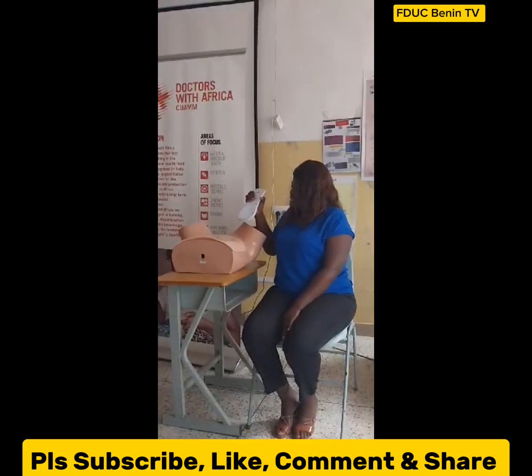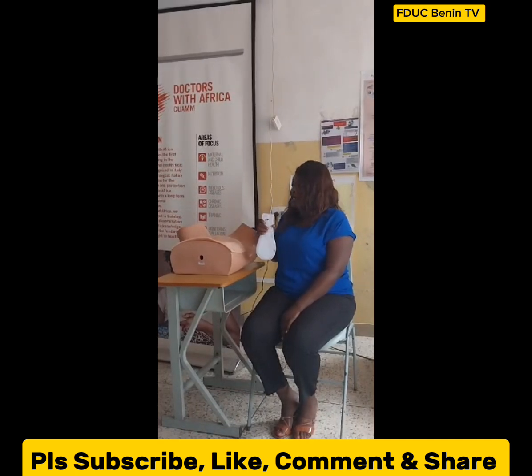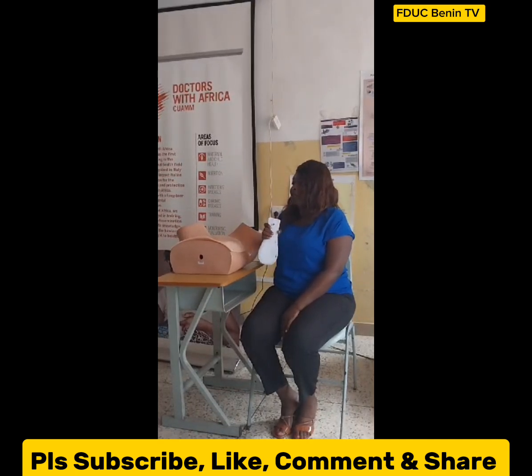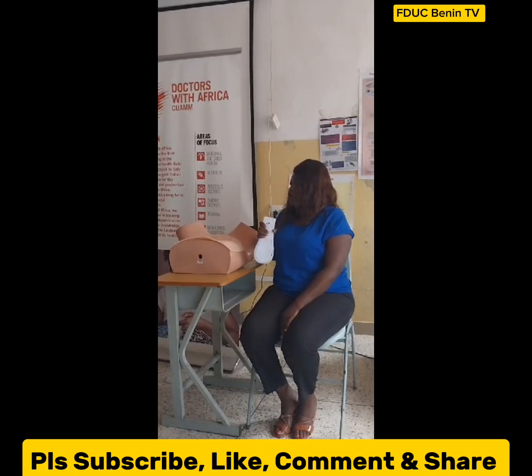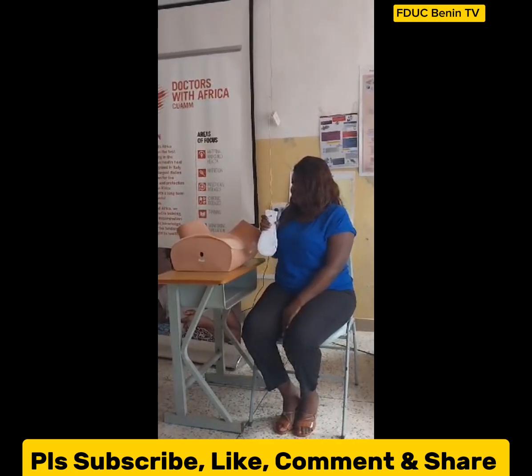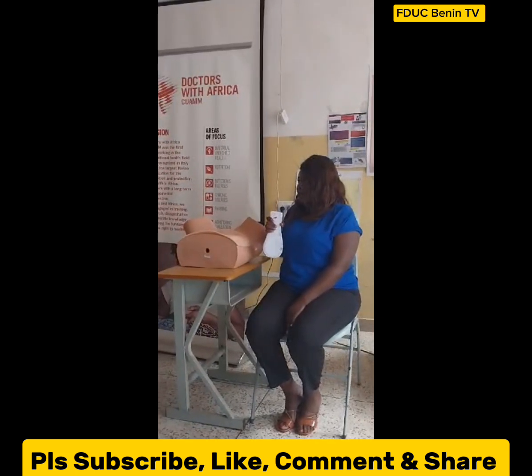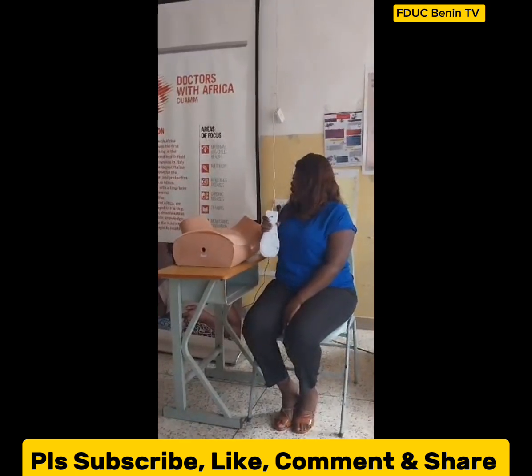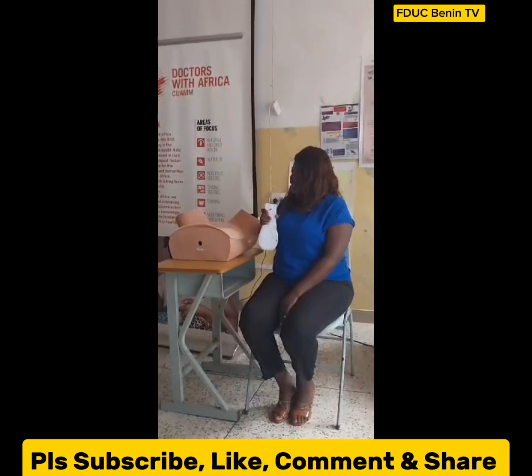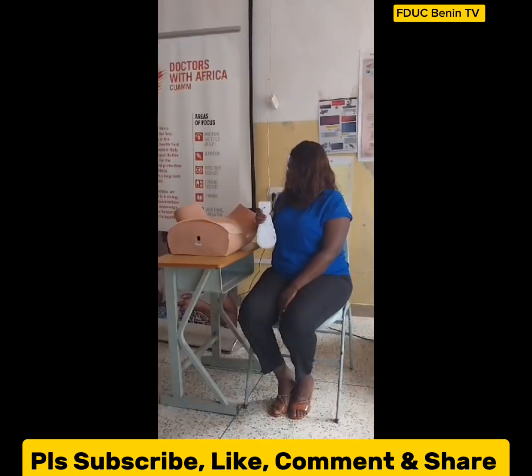So after doing that, I should be able to identify whether it's an intrauterine pregnancy or not, and the number of fetuses, also the presentation. I should be able to visualize the placenta in its location, also whether the fetus is viable, the fetal heart rate. I should be able to see the liquor, and then also any umbilical cord.